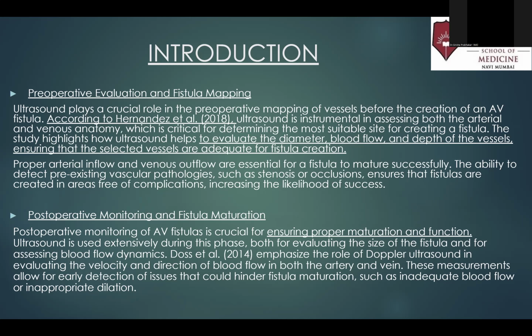Third is broad clinical applications, like preoperative evaluation and fistula mapping to choose the best site for creating a fistula in the patient, and post-operative monitoring of fistula maturation to ensure proper maturation and functioning of the fistula.